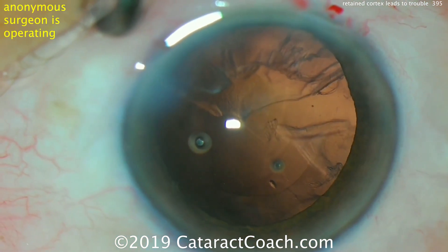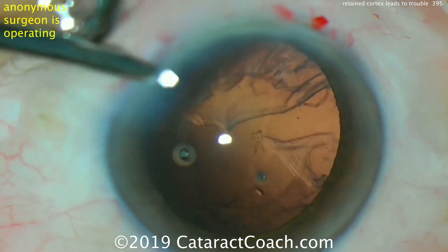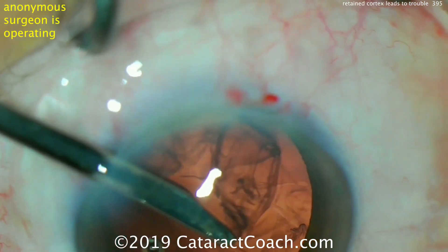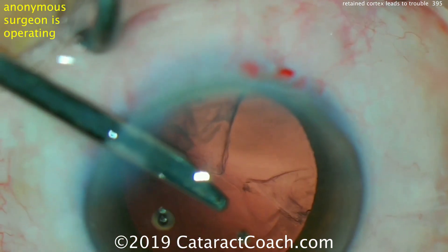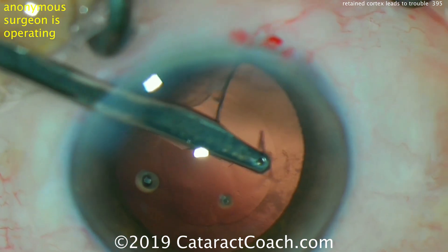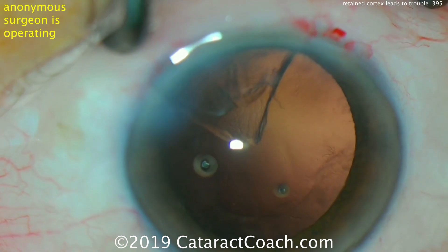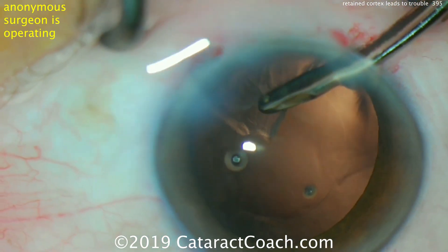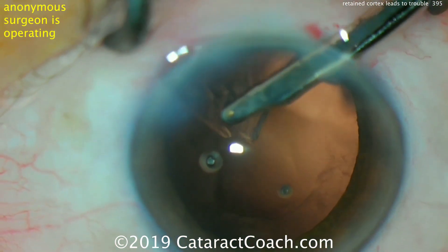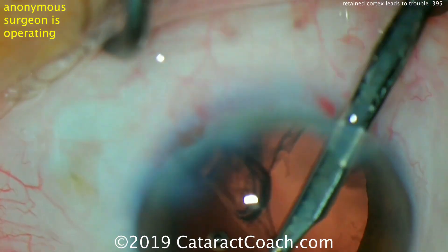The best approach is to clean out as much as possible. Remember that lens proteins — the crystallins — haven't been seen by the immune system, so they're going to cause a very strong inflammatory response. Any bit of cortex left behind tends to hydrate and swell in the post-op period, and even if left at the equator of the lens capsule bag, it tends to migrate towards the center of the pupil.